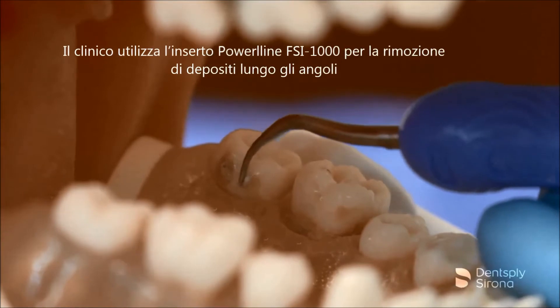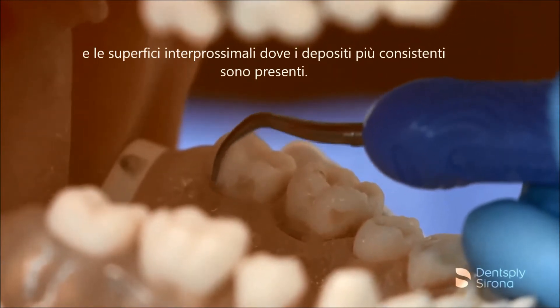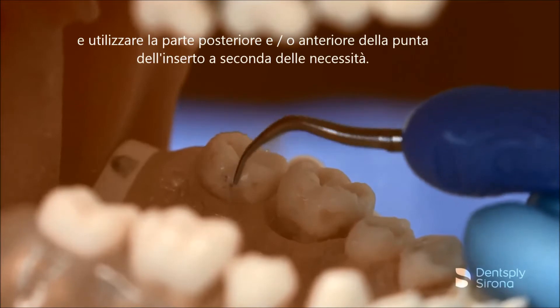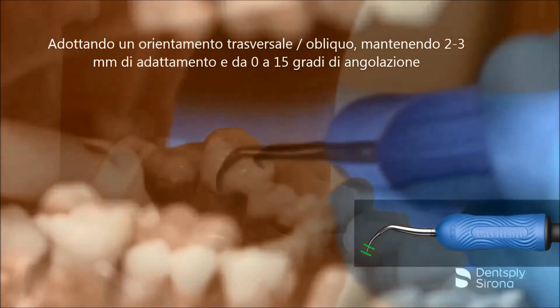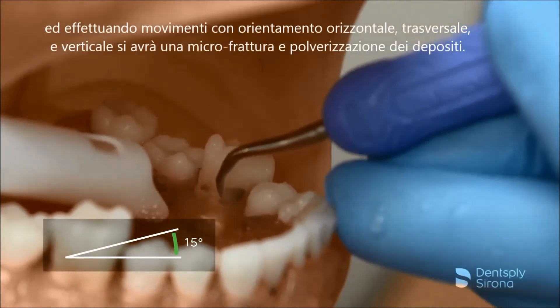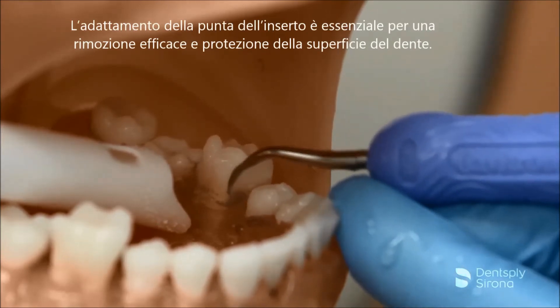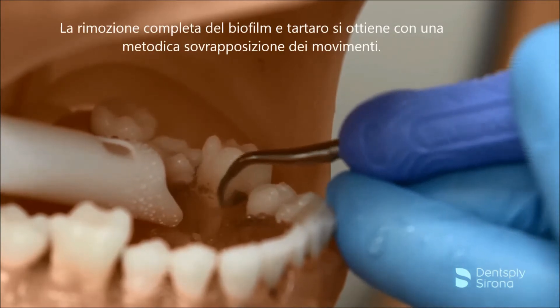The clinician utilizes the Cavitron FSI 1000 insert for deposit removal along the line angles and interproximal surfaces where heavier deposits are present. Adapting the lateral surface on the clinical crown, and using the back and/or face of the insert tip as needed, the clinician utilizes a transverse orientation, maintaining 2-3 mm of adaptation and 0-15 degrees angulation with strokes in the horizontal, transverse, and vertical orientation to micro-fracture and pulverize the deposits. Adaptation of the terminal end is essential for effective removal and protecting the tooth surface. Thorough biofilm removal and calculus is achieved with an overlapping methodical stroke pattern.